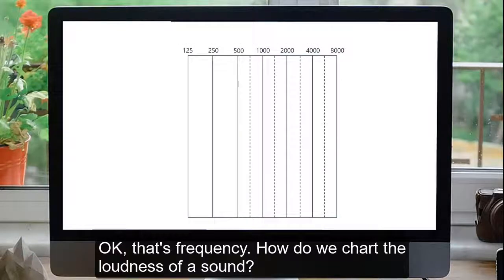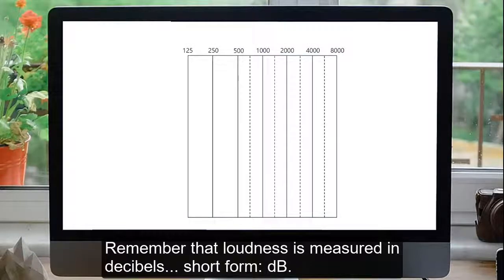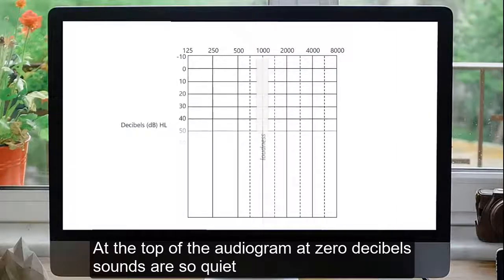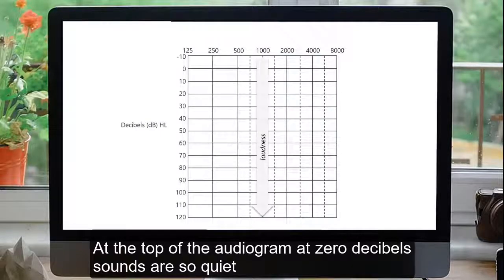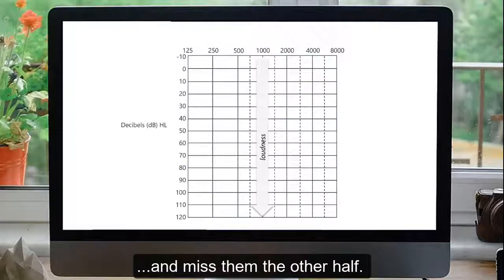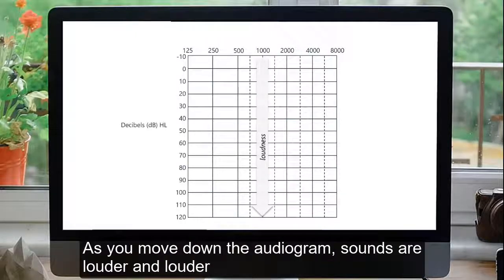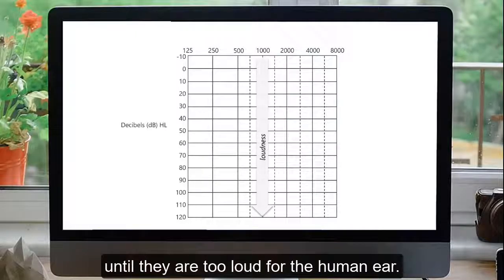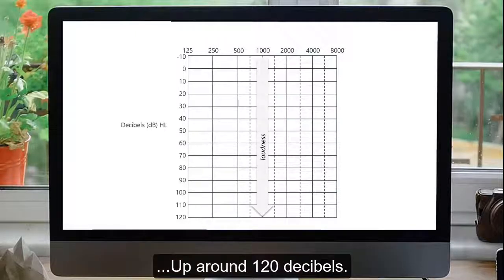How do we chart the loudness of a sound? Remember that loudness is measured in decibels, short form dB. At the top of the audiogram, at zero decibels, sounds are so quiet you might, with typical hearing, just be able to hear them half the time, and miss them the other half. As you move down the audiogram, sounds are louder and louder until they are too loud for the human ear, up around 120 decibels.